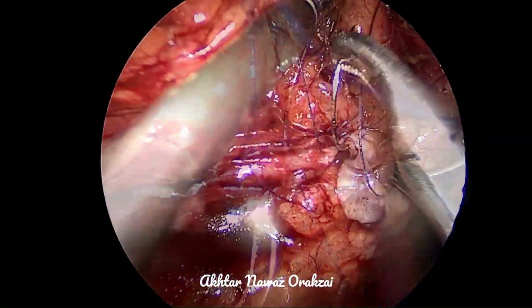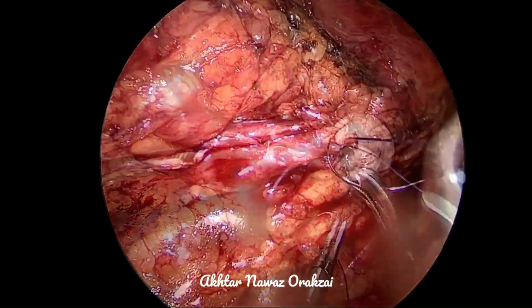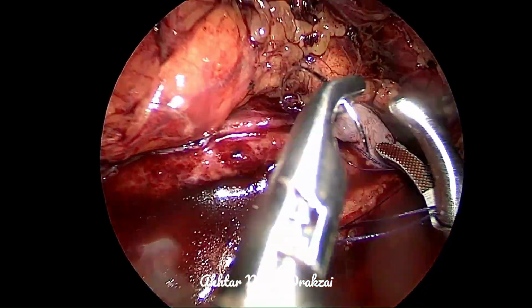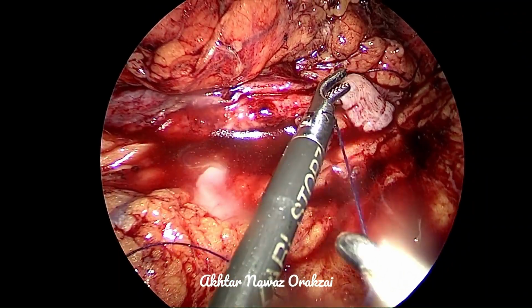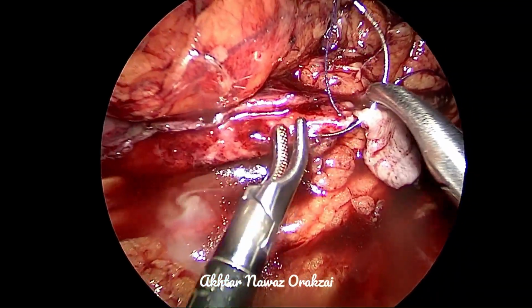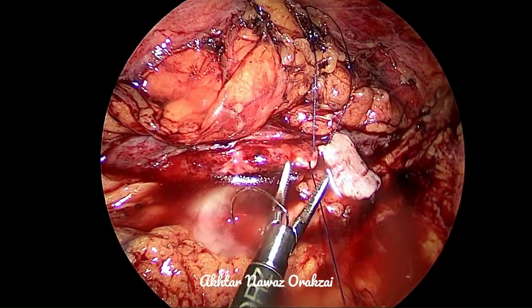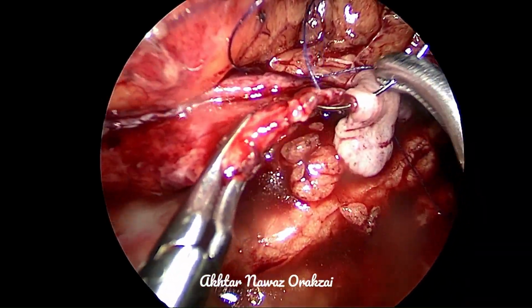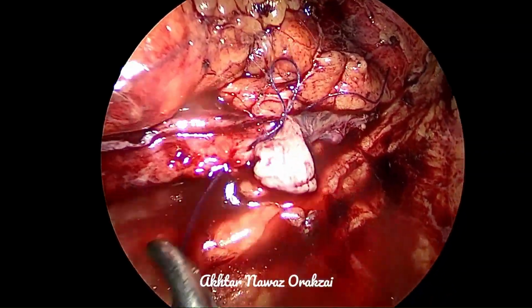The first few stitches need to be extremely fine, through and through the lumens of both the ureter and the pelvis, equally distanced and very near to the edges, because this part of the anastomosis is really going to decide the fate of this pyeloplasty. So the initial few stitches need to be taken with extreme caution. Vascularity is the most important factor deciding the fate of the pyeloplasty or reconstruction.